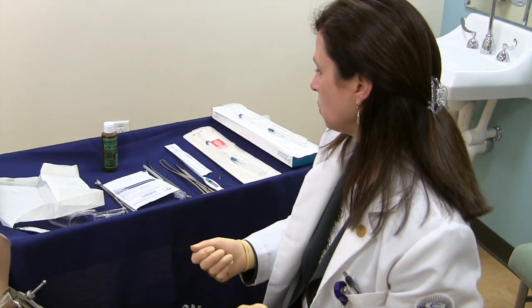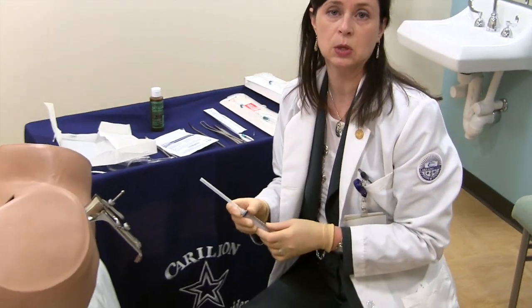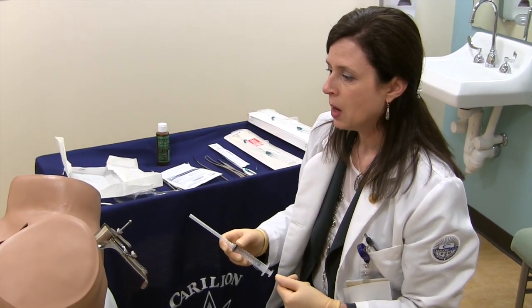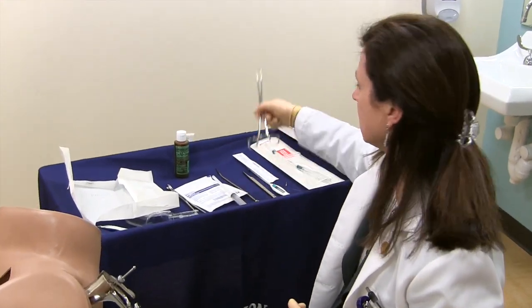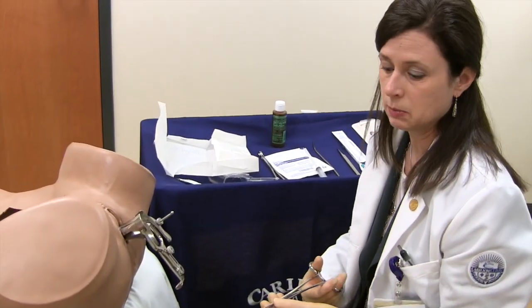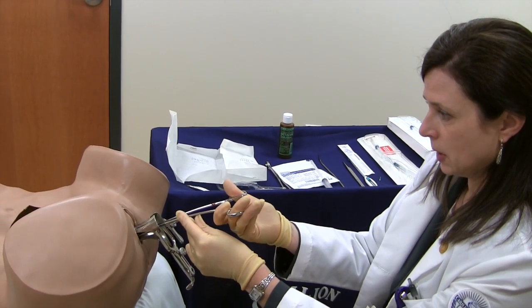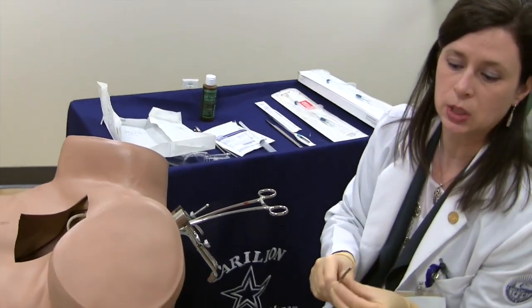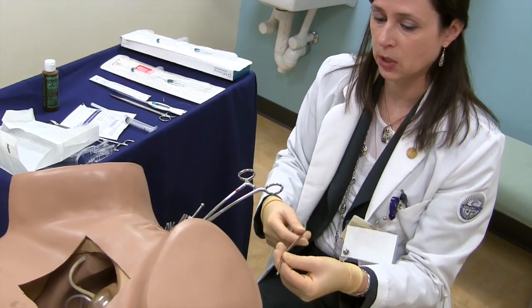One could talk through that step as well. Another option that can be discussed depending on faculty preference is the use of any type of anesthetic — whether it's injecting lidocaine as demonstrated in the teaching video or using a cervical block. Any of those are certainly possibilities to practice at this stage of the workshop. Next, after that step, is the use of the tenaculum. This is something you can use with the GYN simulator model — carefully doing a tenaculum placement and then sounding the uterus. With the metal sound, one could highlight and teach how to adjust it depending on whether one palpated an anteverted or a retroverted uterus.